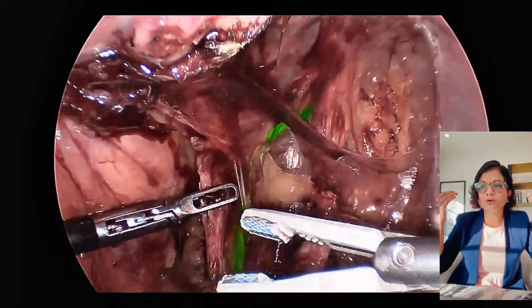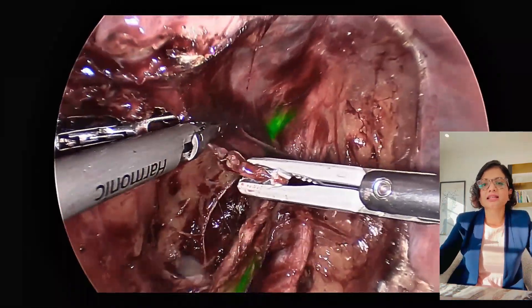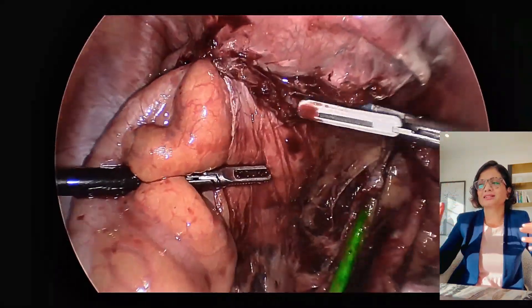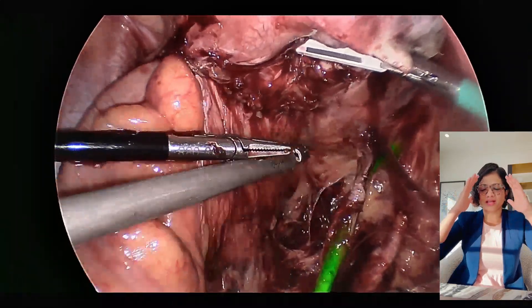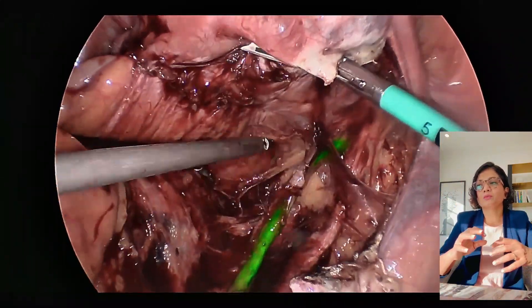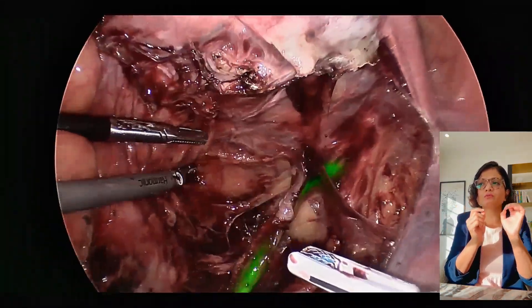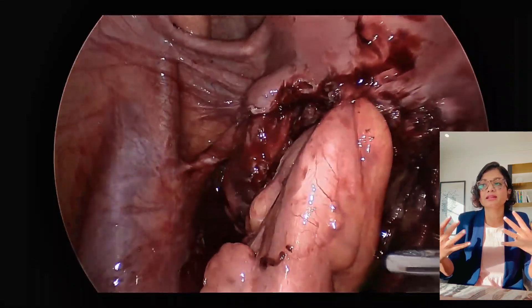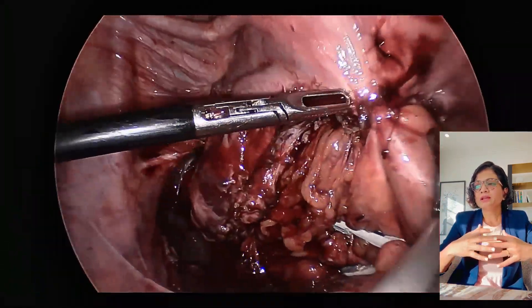With ICG, the cognitive load is reduced. I don't have to worry about where the ureter is or check for vermiculation — I know it's lit green and there's nothing else green in the pelvis. So even when I'm doing important steps like this, I know that the ureter is far away and I can cut a bit more quickly. Surgeons have a working memory — an acute space you use during active surgery where you want to reduce the load. It's like a CPU: you don't want multiple applications running at the same time. Here, I just want to concentrate on dissection and making sure my margins are clear, which is safer for the patient and also reduces the cognitive load for the surgeon.